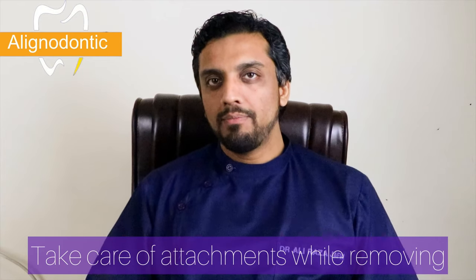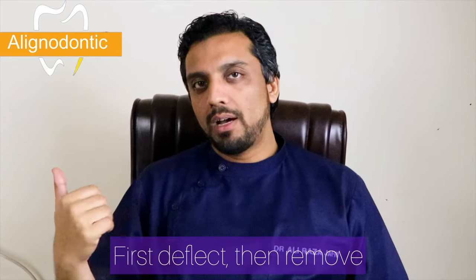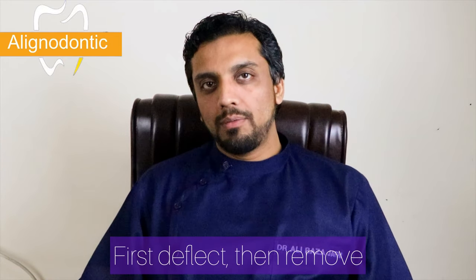You have to remove the aligners from both sides. You will be able to deflect the aligner from the front so the attachment areas will move towards the sides, and then you remove all sides evenly. A very common error is trying to remove one side only, which may cause a slight breakage in the area of the canines.